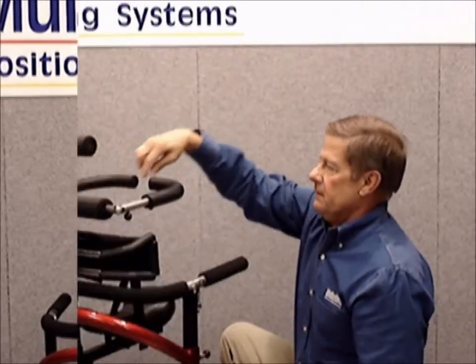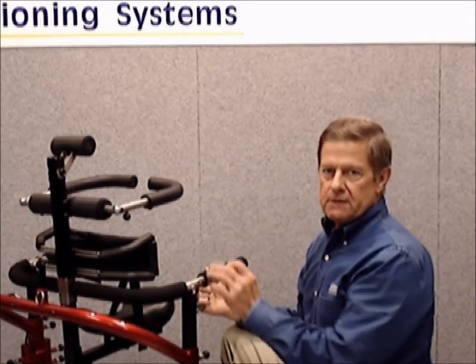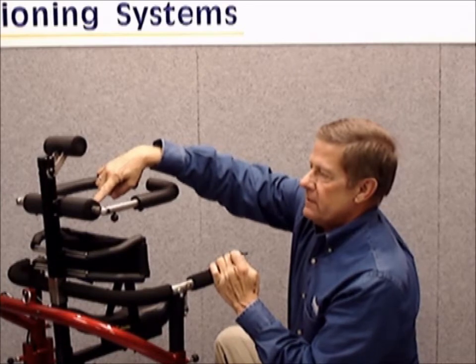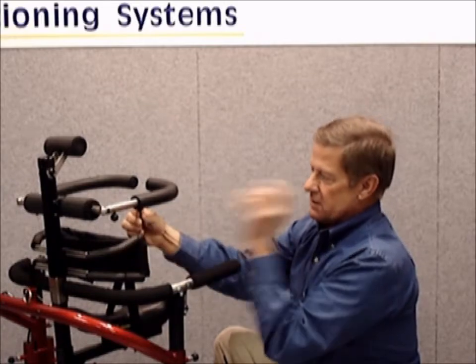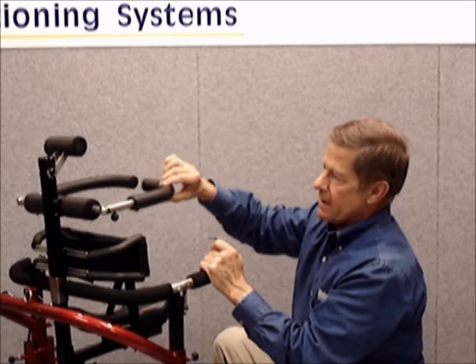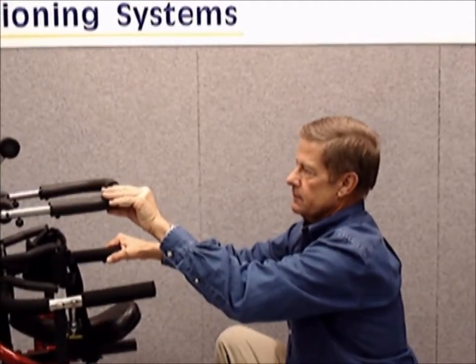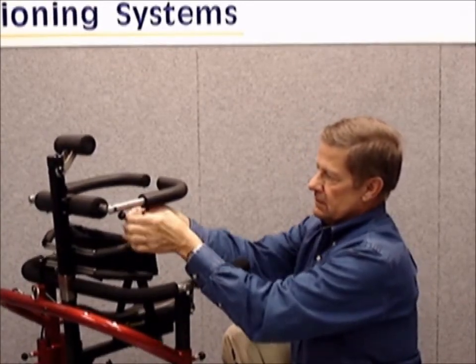Next, we will adjust the trunk depth on the thoracic support. That is found again on page 15 of your user's manual. Number 4 is the measurement you will select. That measurement will be taken from the inside of the front of the thoracic support to the back. Loosening the Allen screw on each side of the thoracic ring will allow you to move the pad forward or back. Select your desired length, making sure that both are symmetrical to the rear. Then tighten securely both Allen screws on the bottom side of the thoracic.